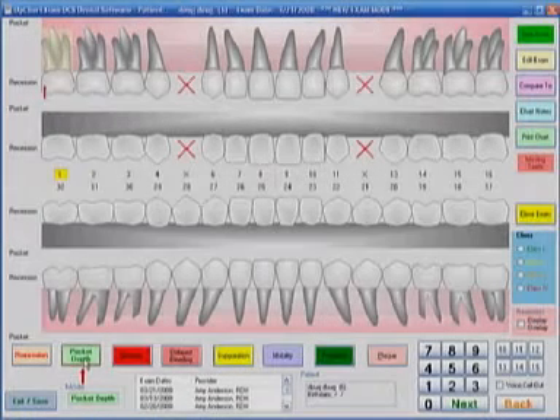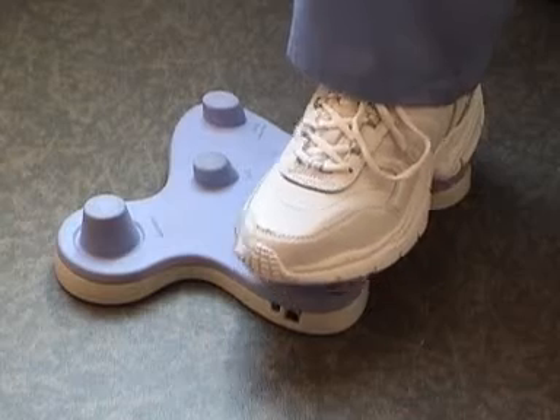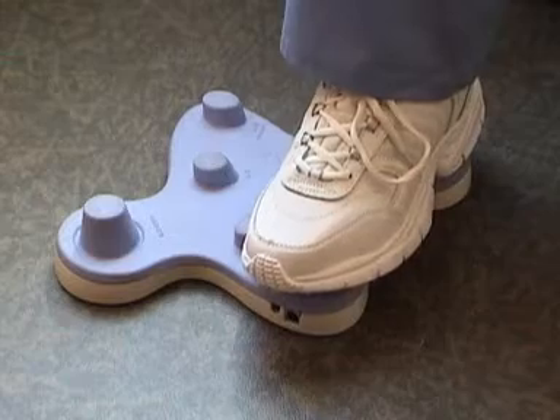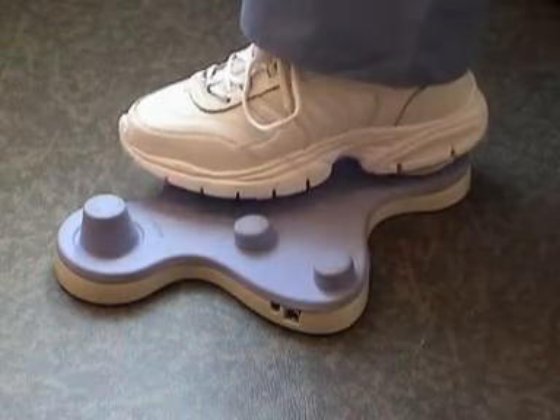This is the OpChart Perio program. You're now ready to begin entering numbers into the computer. To do that, just press the button down and press the left two buttons down. One, two, three, four. Hold it down for the higher numbers: five, six, seven, and eight.